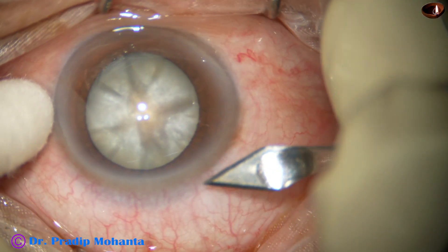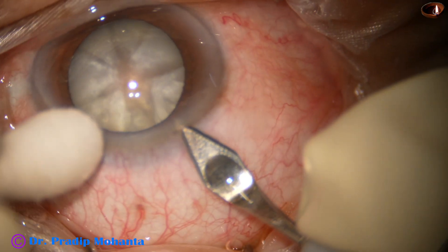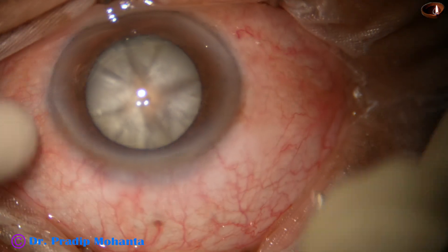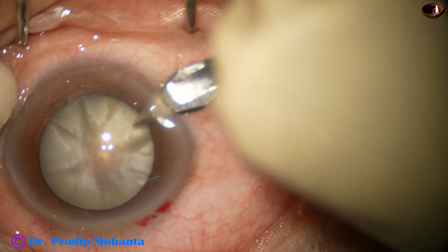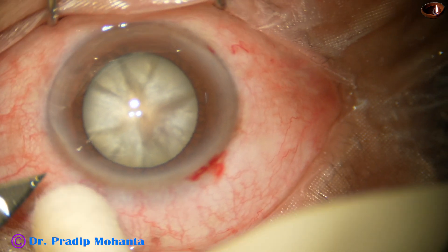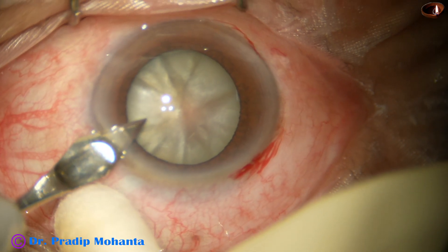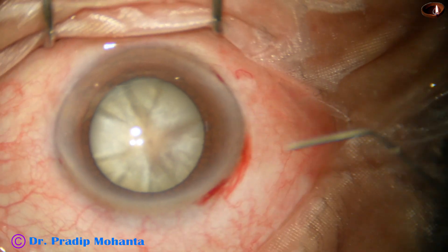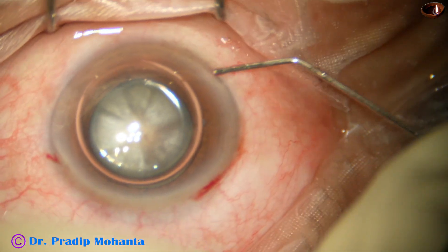This is an intumescent cataract. In fact, the lady has bilateral intumescent cataracts. The patient came today and we have planned surgery on the same day. We have prepared the eye with application of povidone iodine 5% for 5 minutes before taking the patient to the operation table.